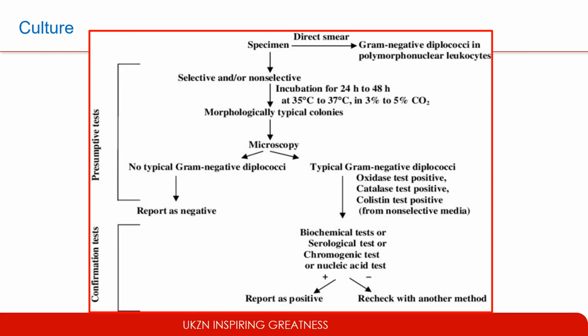Suspected pure isolates will then have to be subcultured and further incubated for about 24 to 48 hours. After this, it will go through the same route of biochemical assays, and lastly, a nucleic acid amplification test can also be used to confirm identity. All in all, this could take up to 5 days just to say yes or no, is it Neisseria gonorrhea?